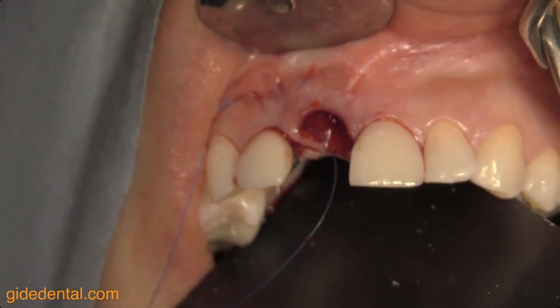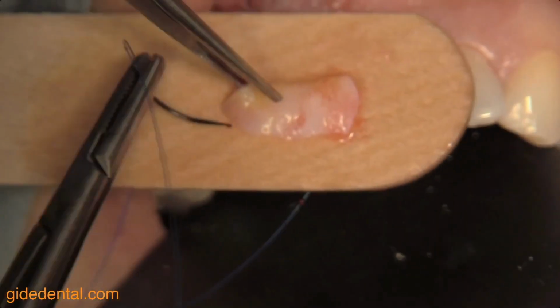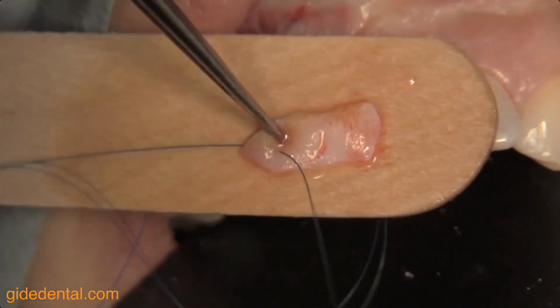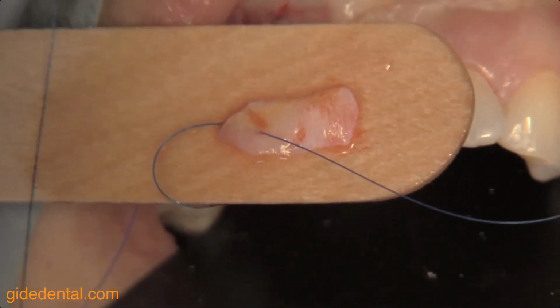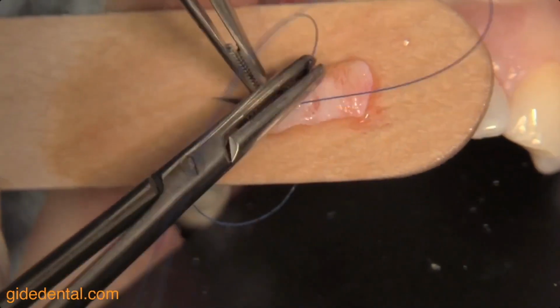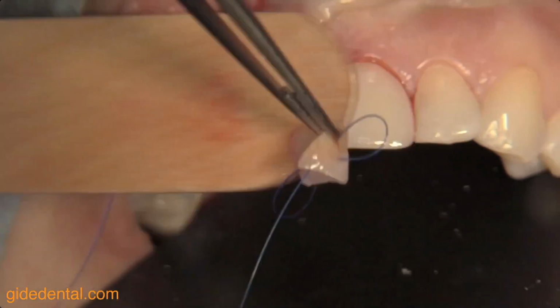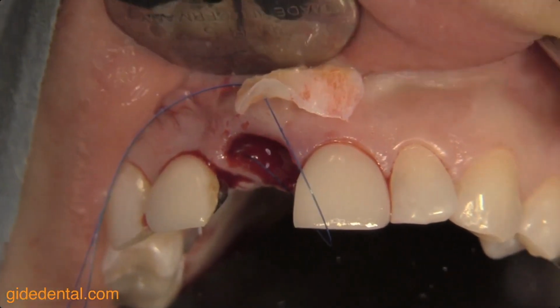So this, of course, is a very fine treatment, and you have to really work very carefully. Also, you have to have stable hands here, so you need good help. Some tremor, some shaking, of course, is normal, especially in the beginning of learning these techniques. It also depends, of course, if you just had a coffee, some caffeine before, that's probably not a good idea. But you can see how I grabbed it.